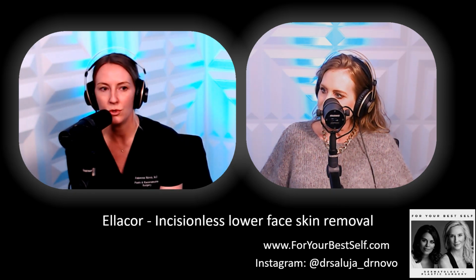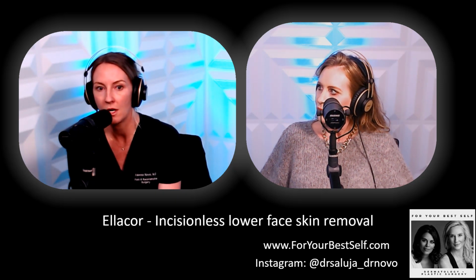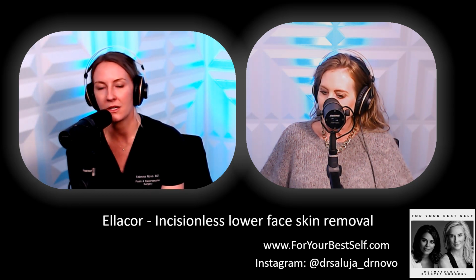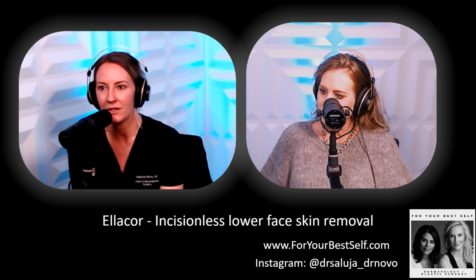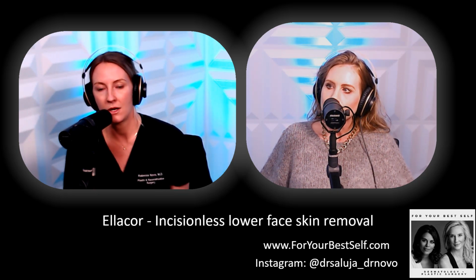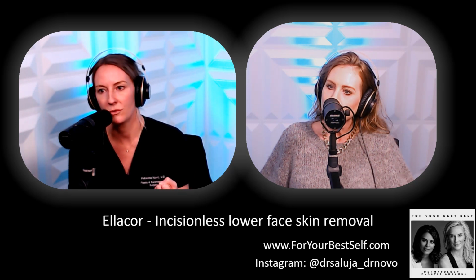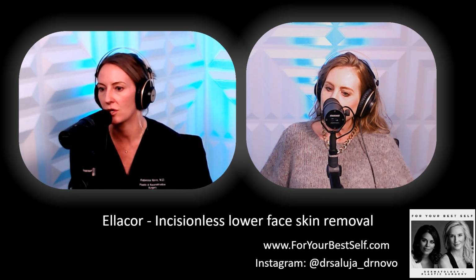I think, in speaking to new, I think Heather's brave, and sometimes new is intimidating or scary, like, oh, are you practicing on me? Or do you know what you're doing? And if you look at the scope of complexity of what we do in our practice, this is a very simple concept, meaning we are punching and removing skin. We'll get into the steps of the procedure, but it's really pretty automated.